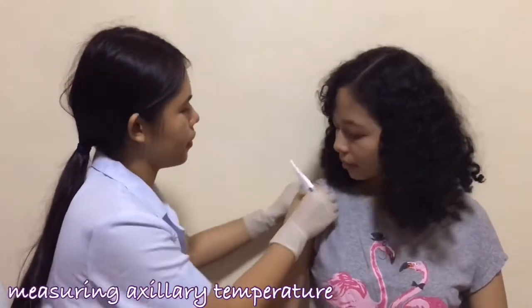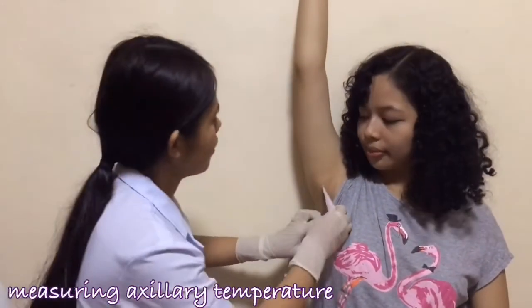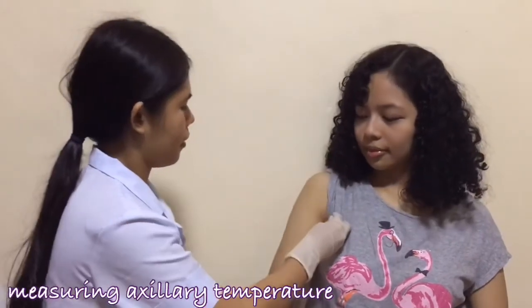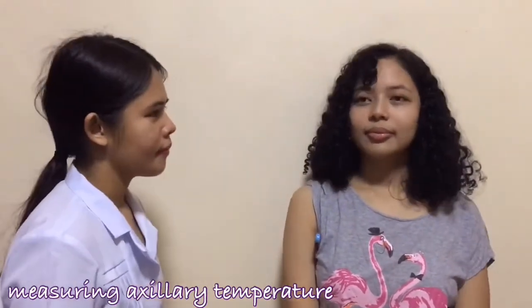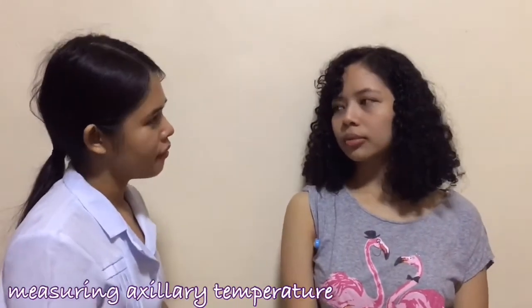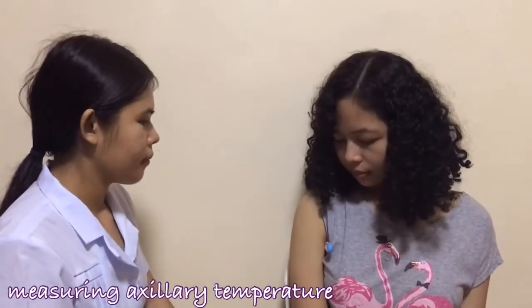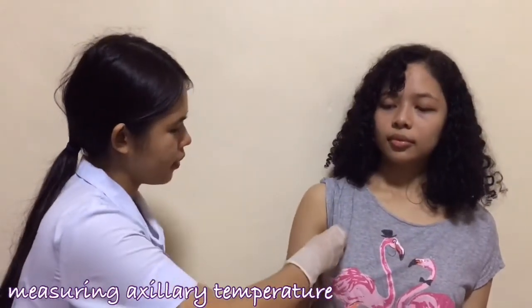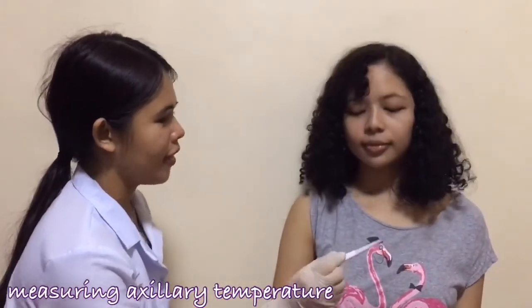I will just lift up your sleeves a little bit. Could you please raise your arm? And now you can put it down and hold the thermometer here until it beeps. Just lift up your arm. Your temperature is 36.1 and it is normal.